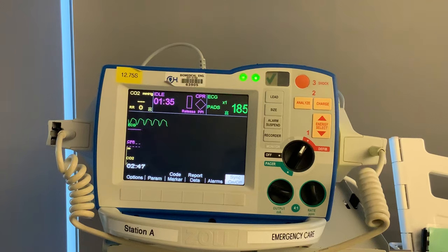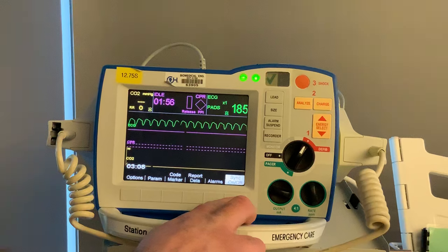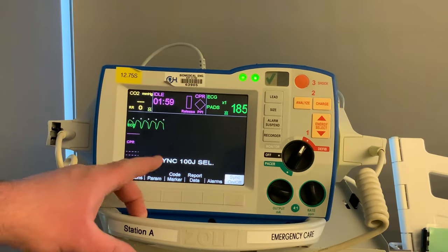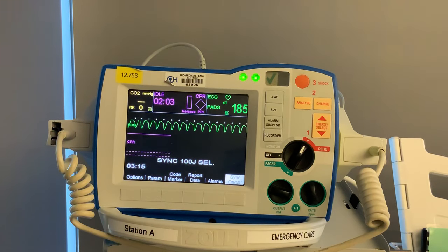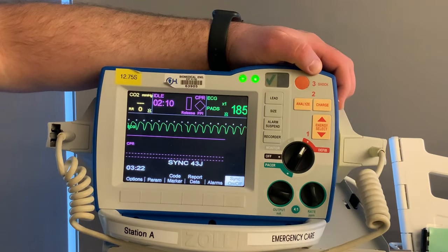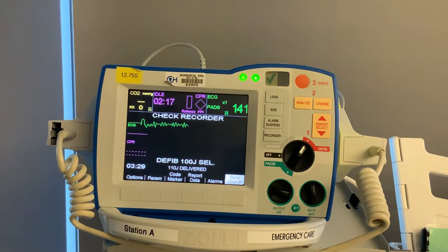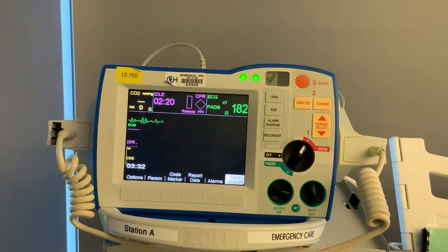After reassessing, we now see VTAC on the monitor. If you see VTAC, the first question to ask yourself is: does my patient have a pulse? Your patient can be VTAC with a pulse or VTAC without a pulse. In this situation, the patient is VTAC with a pulse and unstable, so we do electrical therapy. For synchronized cardioversion: hit the sync button — this puts you in sync mode and you can see the little white dots on the QRS complexes. For VTAC, start at 100 joules. Select energy, hit charge, arm clear, oxygen clear, and press and hold that button.